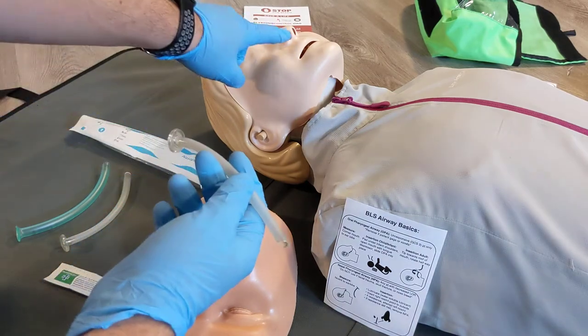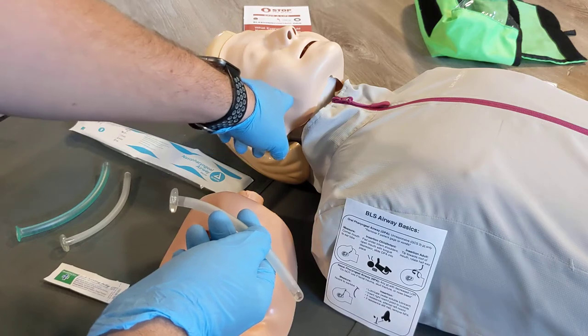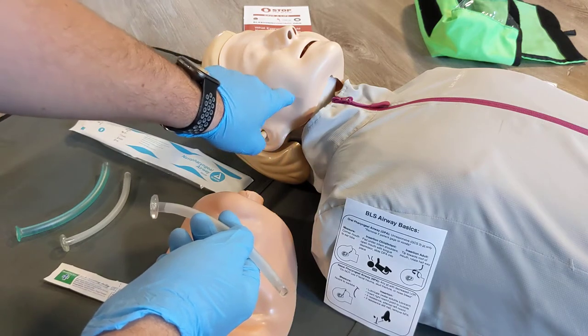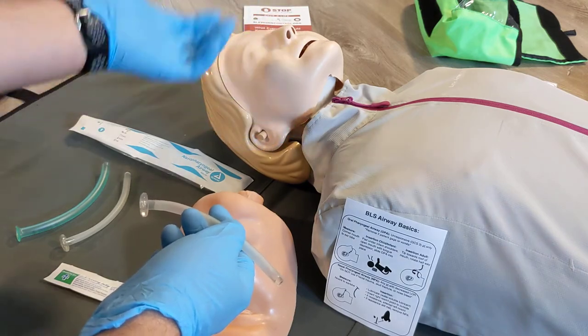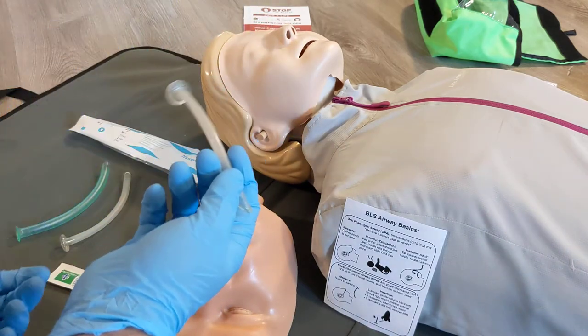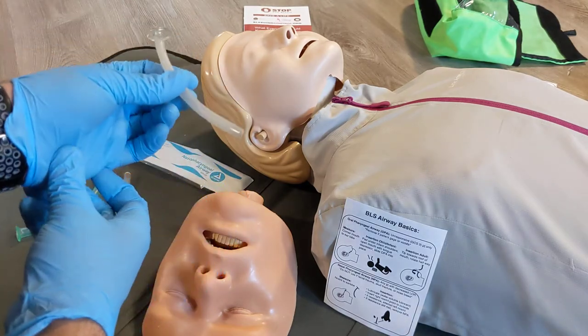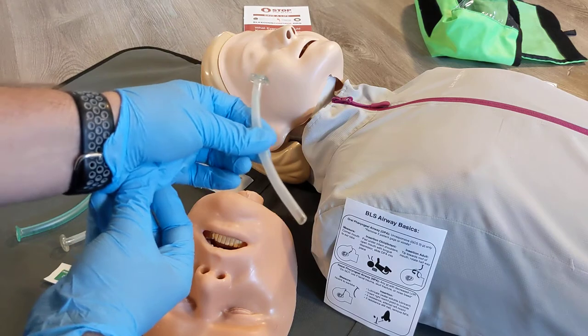These devices are meant to go in through the nose and provide an open airway by getting past the back of the tongue. These still require some sort of airway maneuver usually, such as a jaw thrust, a head tilt, or positioning the patient in the recovery position for them to fully function. But these do assist in improving the airway of a patient who has some sort of cognitive depression.